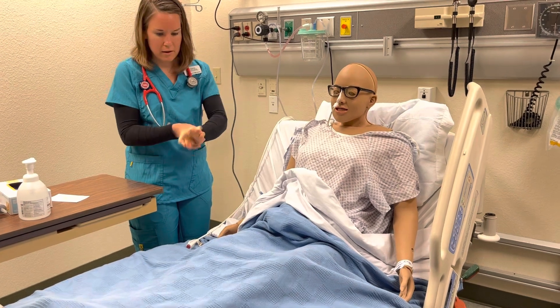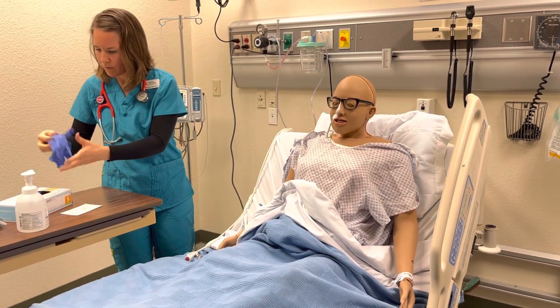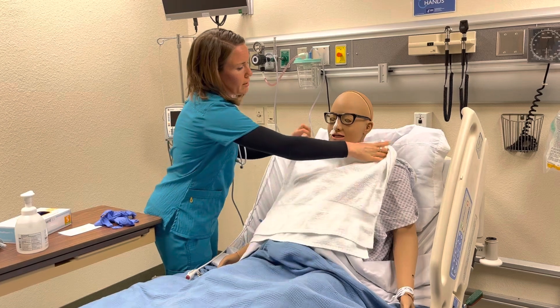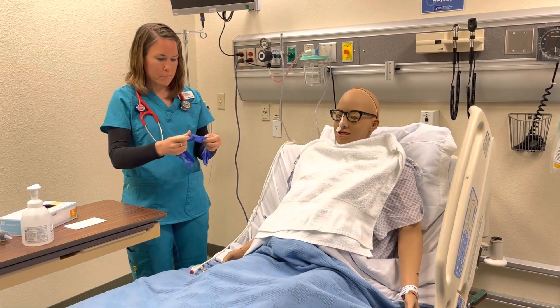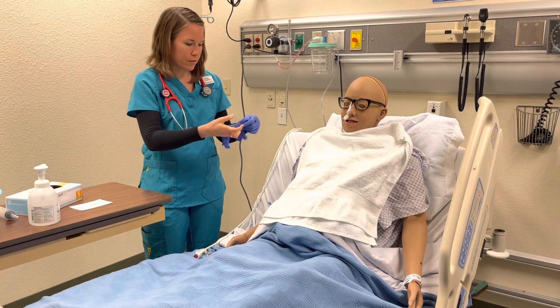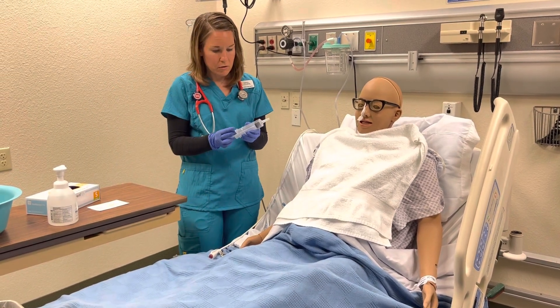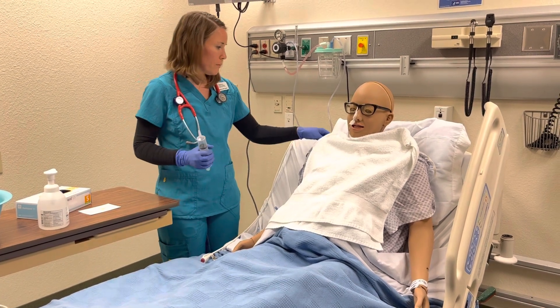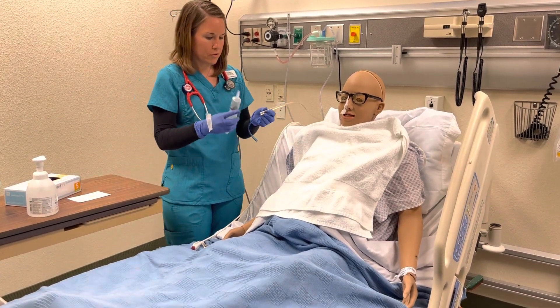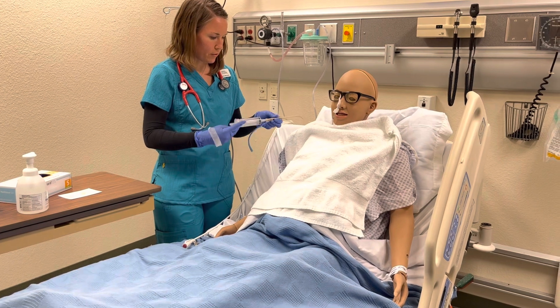I'm just going to wash my hands and put some gloves on so we can start taking this out. I'm going to flush the tube before we actually take it out — that'll just clear any gastric secretions that are there along the tube. Also, we'll have you hold your breath when we take it out; that'll help prevent aspirating. According to my policy, we're going to flush with 30 cc's of sterile water. Getting clearing of those gastric secretions.